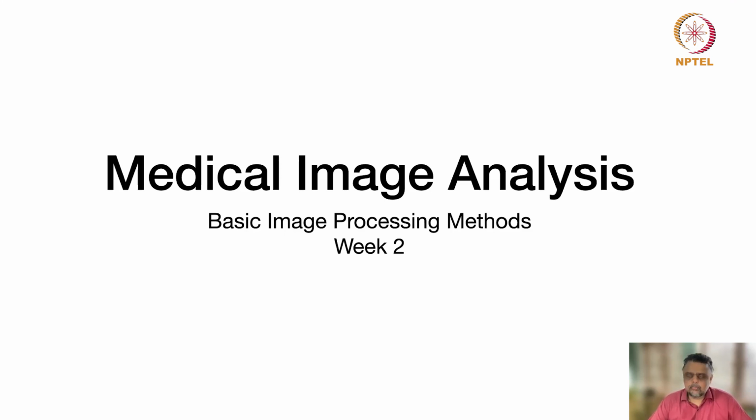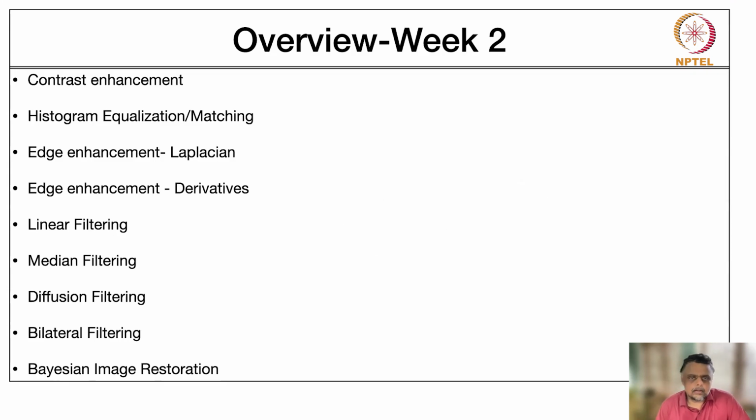And just to give you an overview of what we're going to look at this week, and set it in context. Okay, so the topics we are going to cover this week are contrast enhancement. Okay, so in a lot of cases, when you display the medical image on the screen or on the radiologist monitor, the anatomies of interest are not necessarily highlighted. Okay, so there are various techniques to highlight a certain type of tissue, and that's what we are going to look at in terms of contrast enhancement. We've got the window and level. Okay, so we will see what that is.